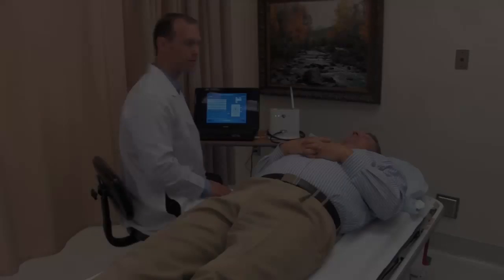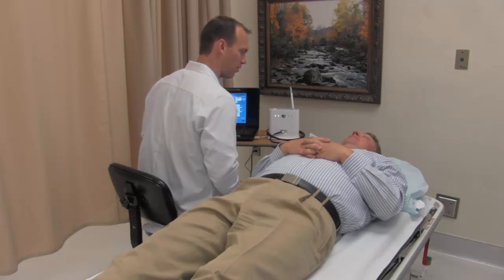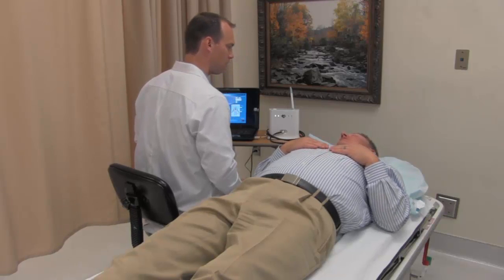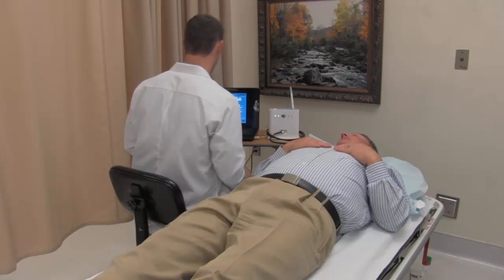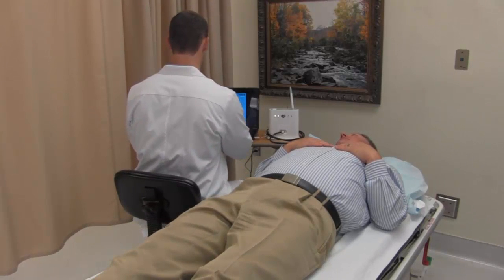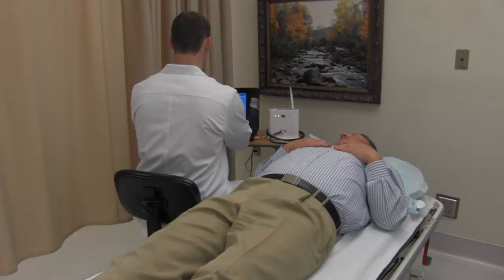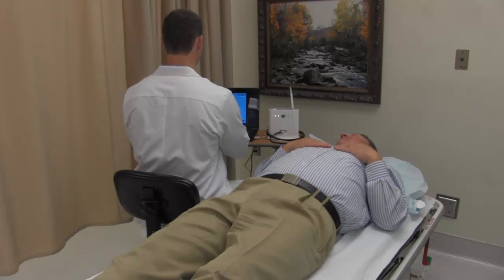It is important when conducting a pulse wave velocity assessment to arrange the room so that the computer screen can be easily viewed by the operator during data capture. In most cases, this is achieved when the computer is placed next to the head of the bed or exam table, the same end where the patient's head will rest. If the screen is in a position that is difficult for the operator to view, it could make data capture challenging.